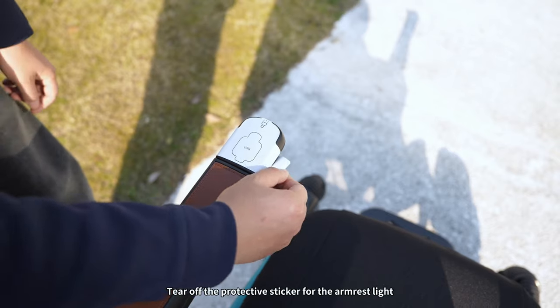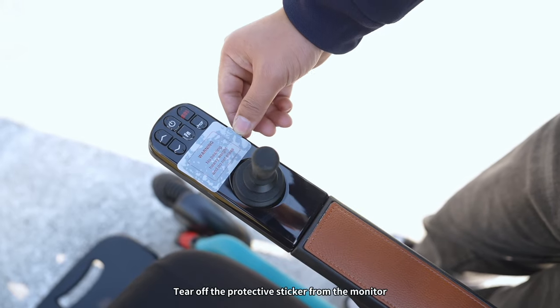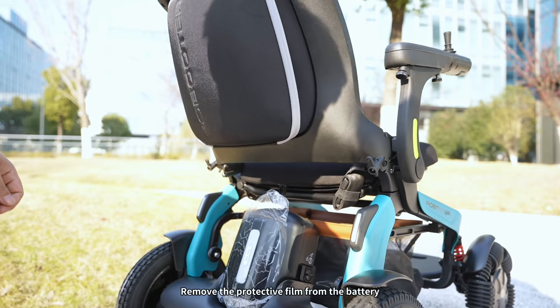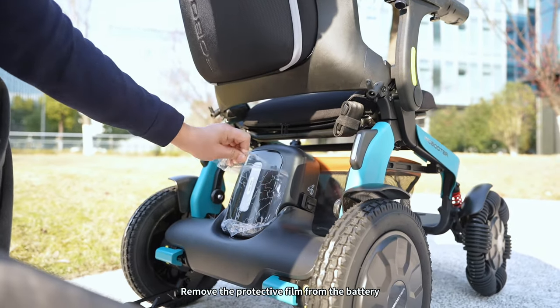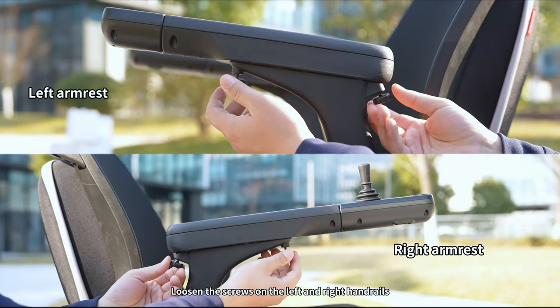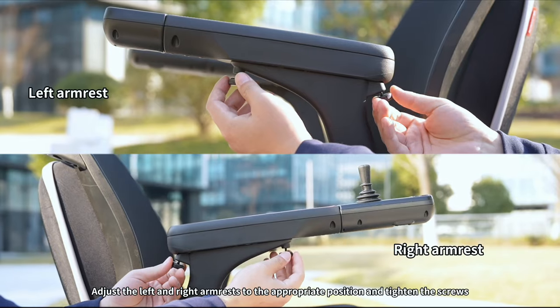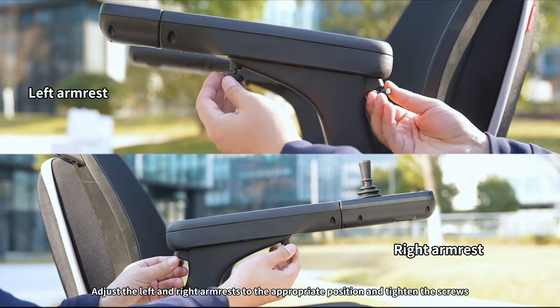Tear off the protective sticker for the armrest light. Tear off the protective sticker from the monitor. Remove the protective film from the battery. Loosen the screws on the left and right handrails, then adjust the left and right armrests to the appropriate position and tighten the screws.